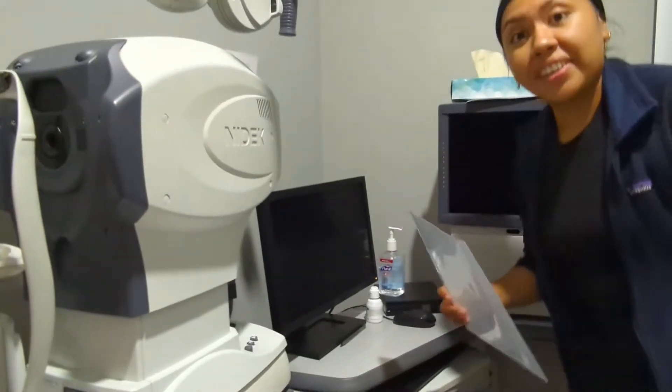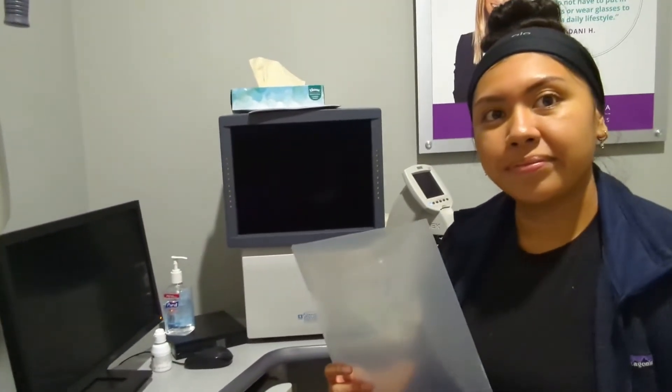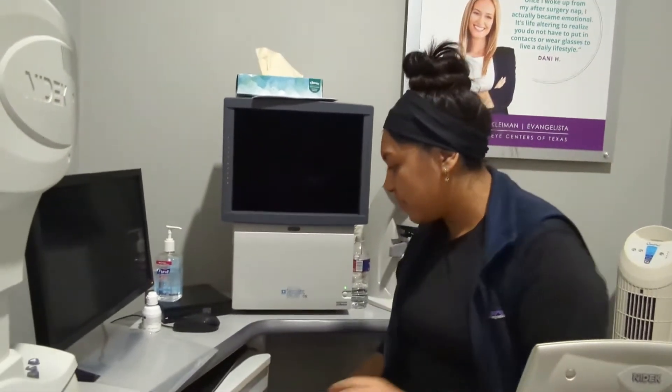Awesome, so today you're here for a cataract evaluation. Let's go ahead and get a couple things done — I'll check your vision, eye pressure, and we'll be taking a few pictures and scans for the doctor today. So we're going to go ahead and get started by checking your vision.